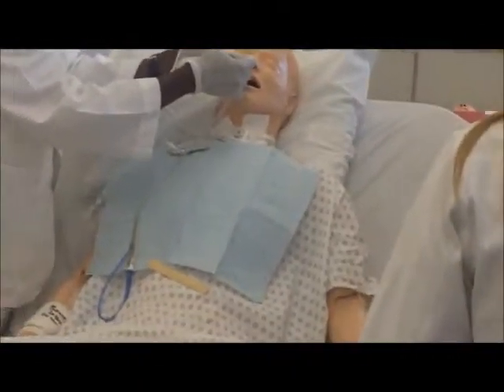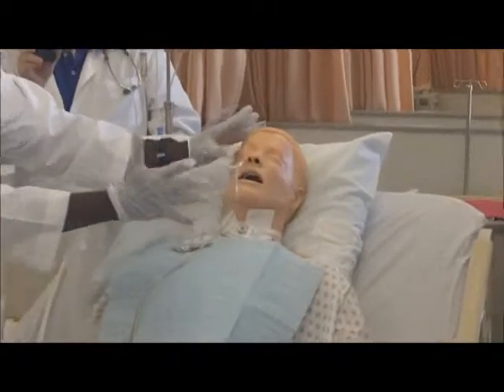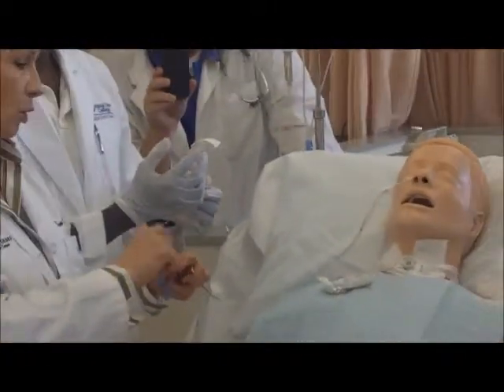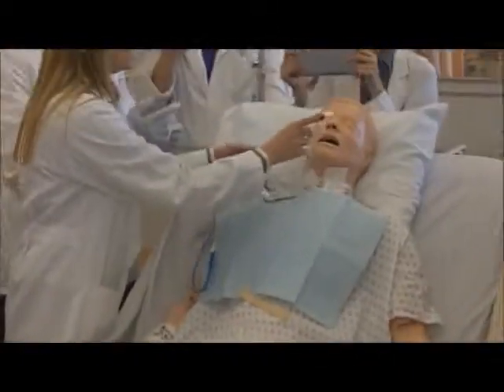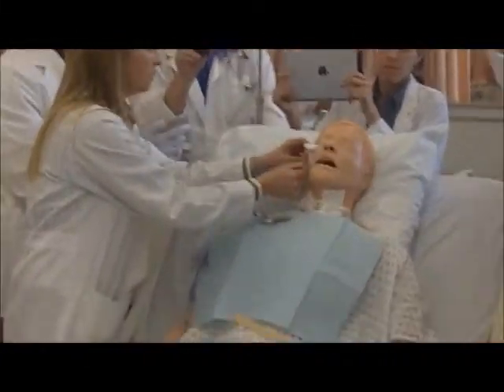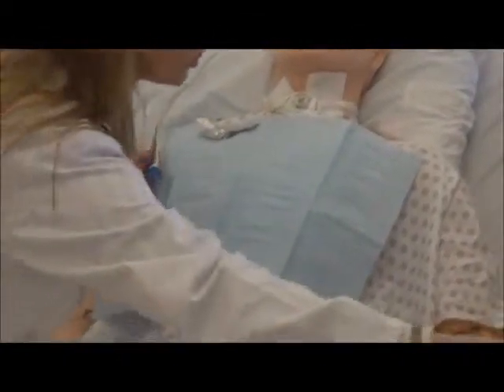To the cheek. That one goes to the cheek, because you don't even know you're in place yet. Now, if you want to start off and clamp this right away, you can clamp it right away. It doesn't matter when you clamp it. Is it okay to clamp it before you start inserting it? You can. That sounds good. Temporarily here, but then you need to remember now you need to grab your piston and your syringe.